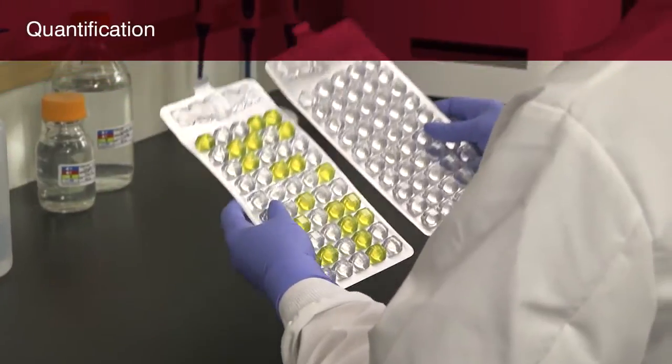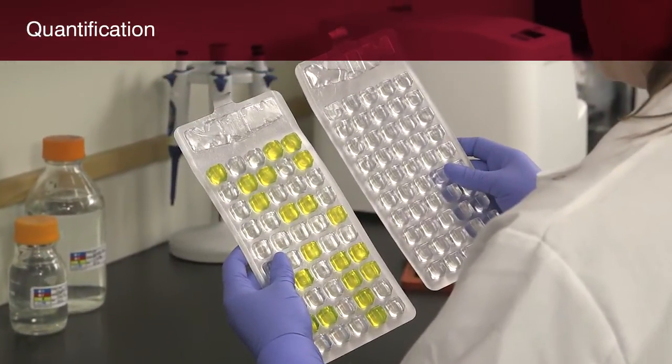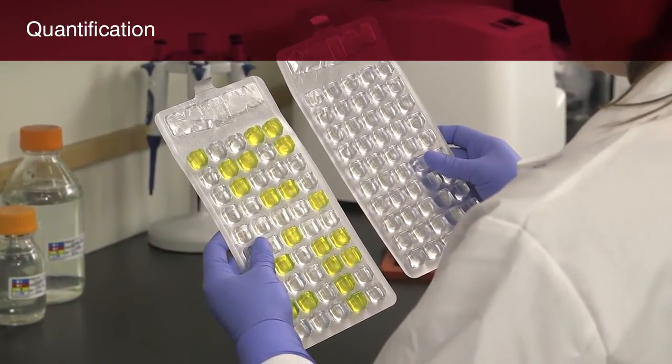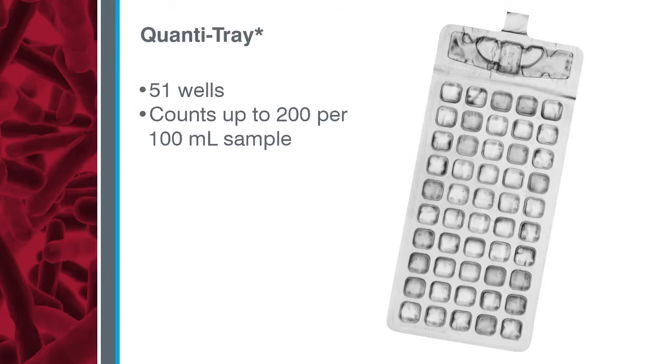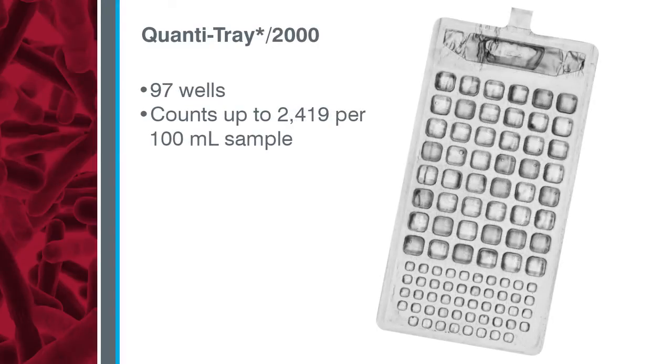Next, you'll learn how to use the ColAlert 18 test with the QuantaTray system to determine the number of coliforms and E. coli in a water sample. IDEXX offers two sizes of QuantaTray, and both work with the QuantaTray sealer. The standard QuantaTray is a disposable 51-well tray that provides counts up to 200 per 100 ml sample without dilutions. The QuantaTray 2000 is a disposable 97-well tray that provides counts up to 2,419 per 100 ml sample without dilutions.